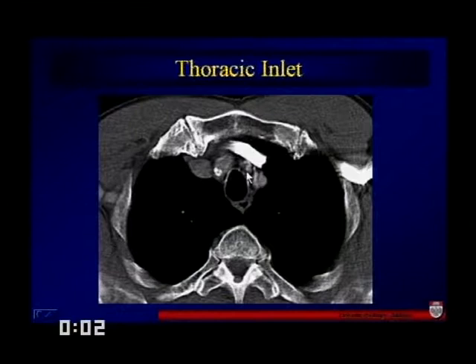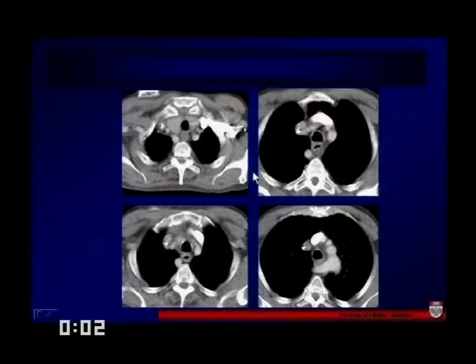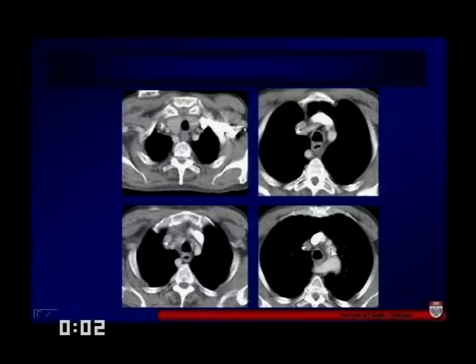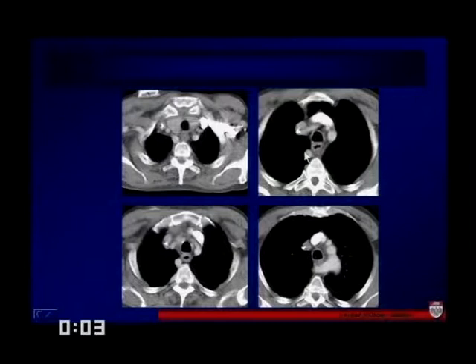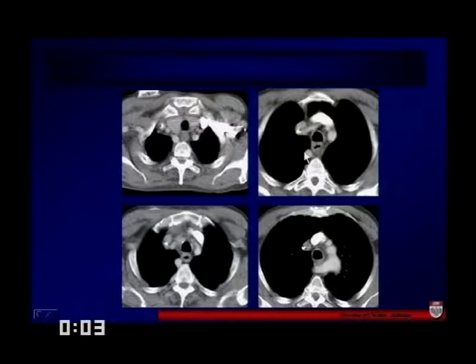This case here shows a variant of normal. Instead of the normal left carotid, left subclavian, and right brachycephalic arteries, we have a large vessel that comes around here — this is an aberrant right subclavian artery. It's something you should recognize because we see it not infrequently. Just glancing at a CT, you might not recognize it, but it can sometimes cause symptomatic indentation on the posterior aspect of the esophagus.